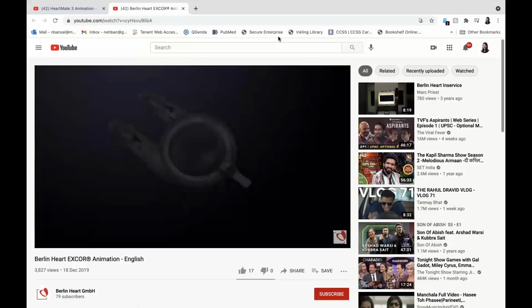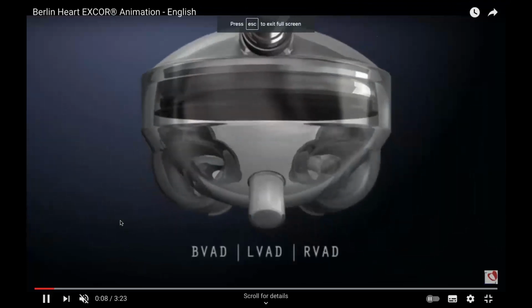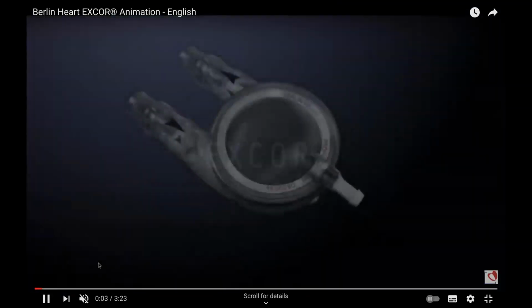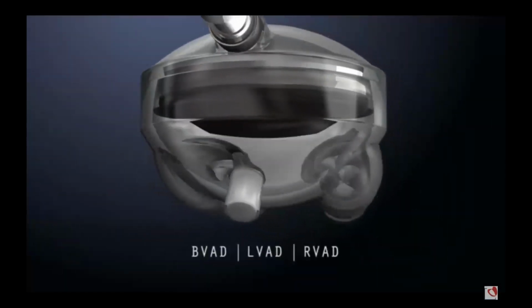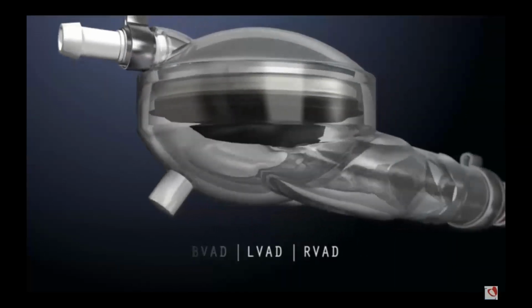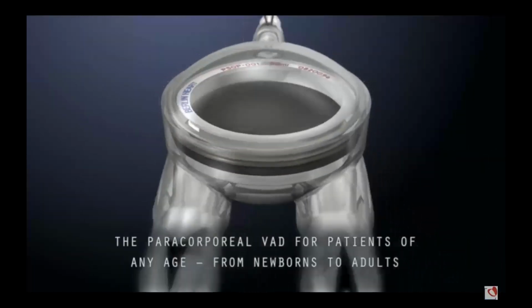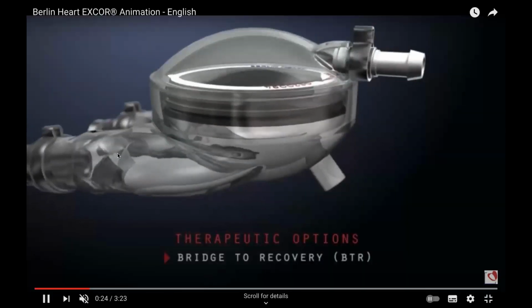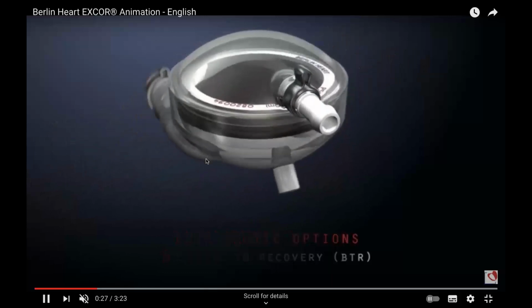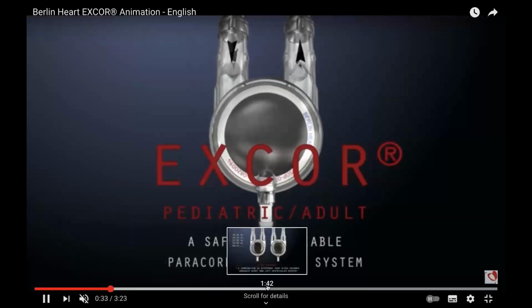I would like to show you a quick video of this device. So as you can see here, just starting from the beginning, this is a Berlin EXCOR pump itself. You see this membrane that is sitting in the center, and it's pulsatile. It moves. There is a vacuum that is created by the machine on one side of the membrane, and it makes the membrane pulsatile, which opens these valves accordingly and lets the blood in and then pushes the blood out. This is how a Berlin EXCOR pump looks.